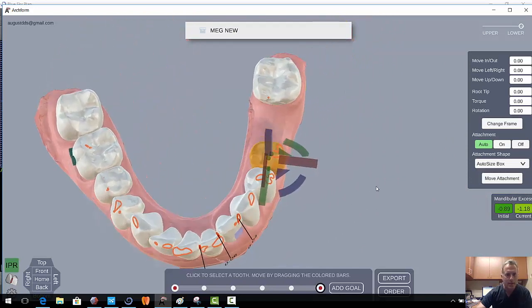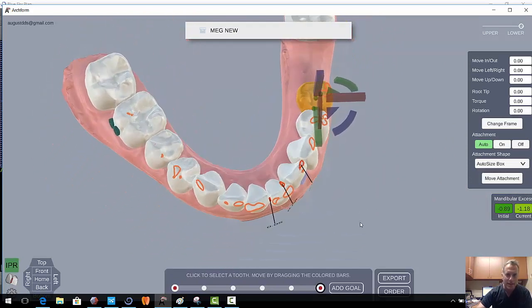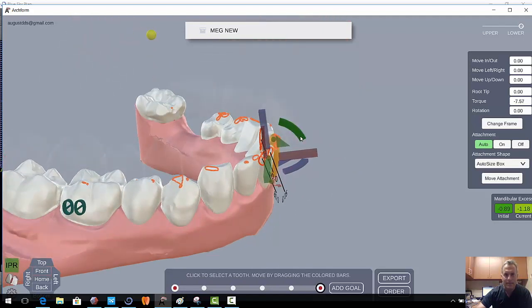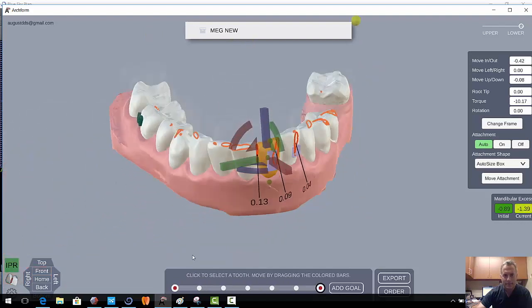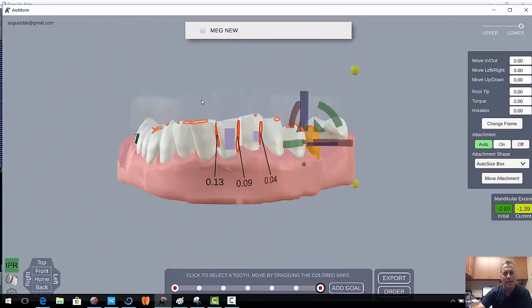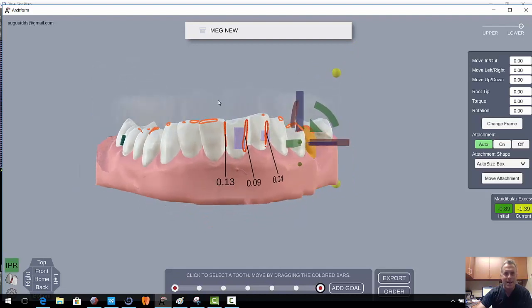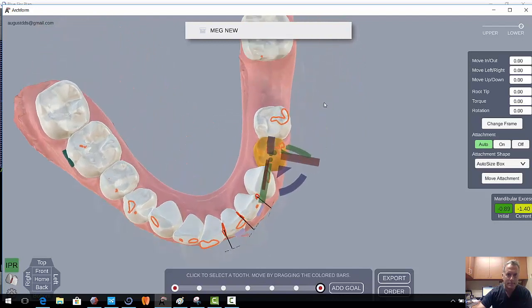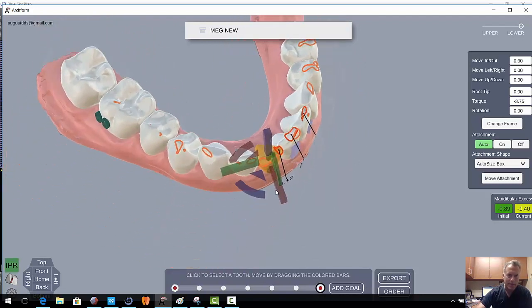We can now just click on another tooth so we can kind of analyze the arch form without the widget in there. It looks like this one still needs to come up a little bit and maybe move in a little bit. Now this patient here, she has some irregular wear on those front teeth, so we may have to do a little bit of enameloplasty, maybe a little extrusion to get that up and where we want it. I'm going to rotate this one a little bit as well.